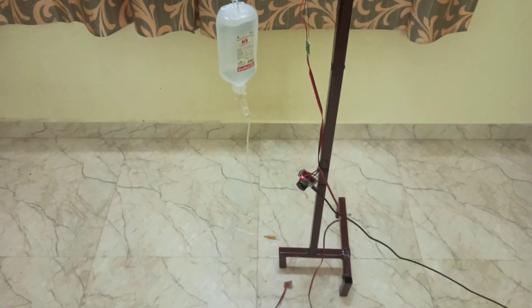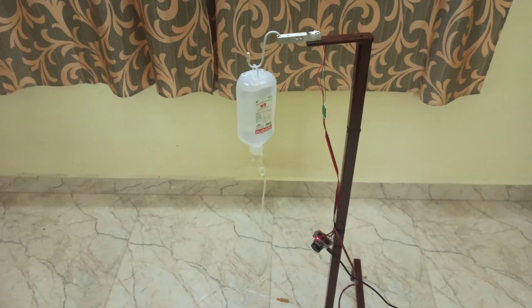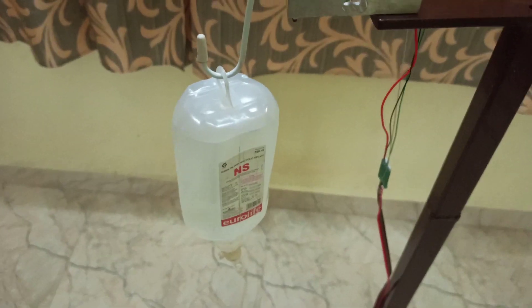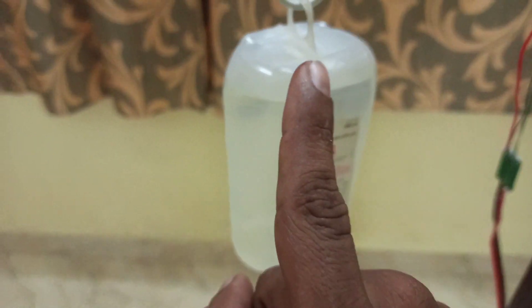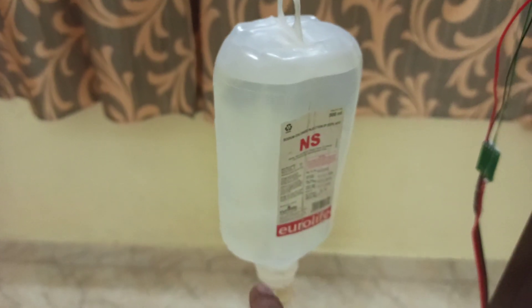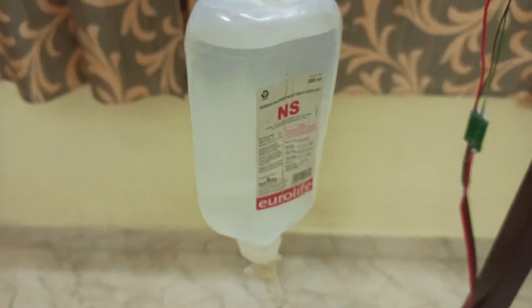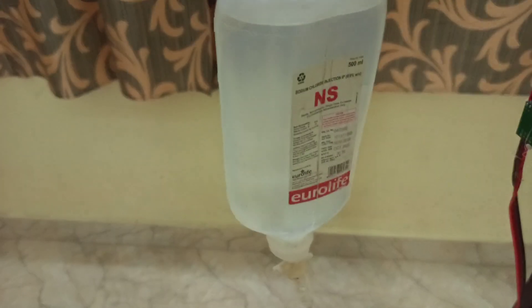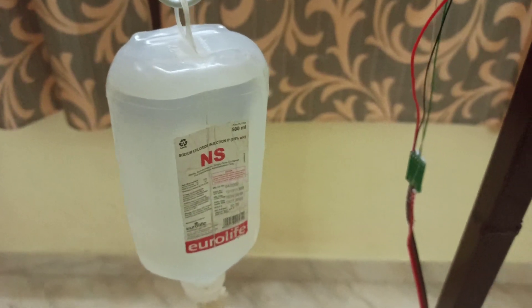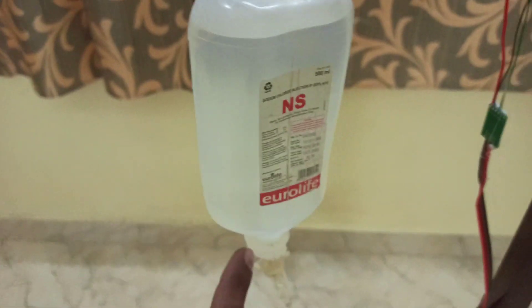Hi everyone, today's project is a drips monitoring system. I'll tell you why we need this project. Assume the glucose in the bottle gets empty — then there will be a vacuum, so the blood from the patient will come back through this tube and enter into this bottle. To avoid this, I have developed this project.